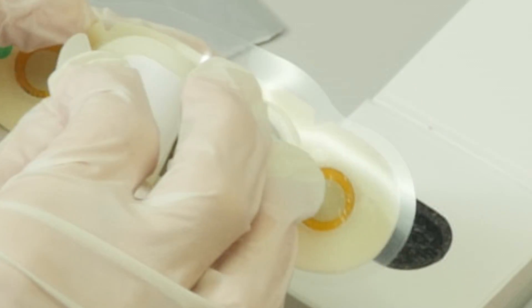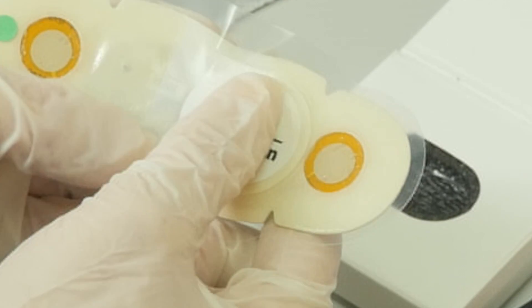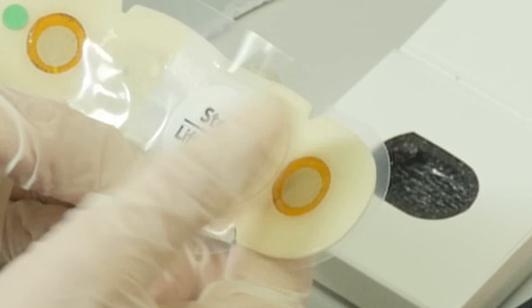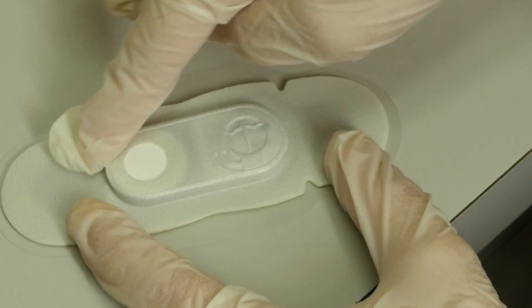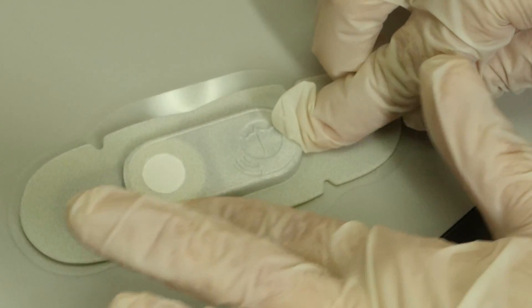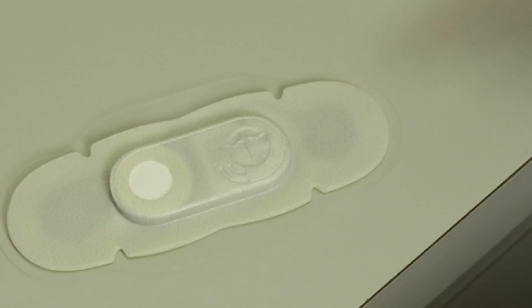Peel to remove the liner from the back flap. Turn the patch over to a smooth flat surface and press down firmly around the module cavity to ensure it is tightly sealed.